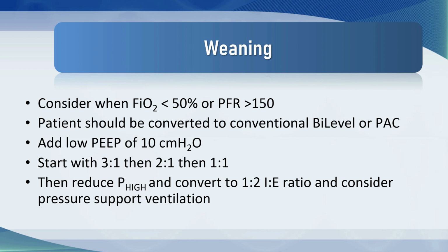And then if they're breathing up very well, of course, it's time to put them onto pressure support. If you're going to go with pressure support, you might need to turn up the PEEP a little bit.